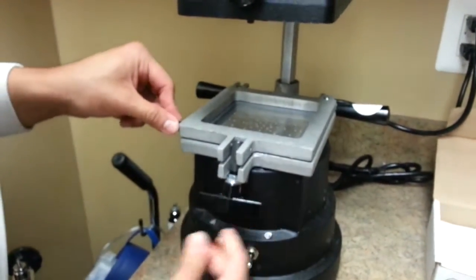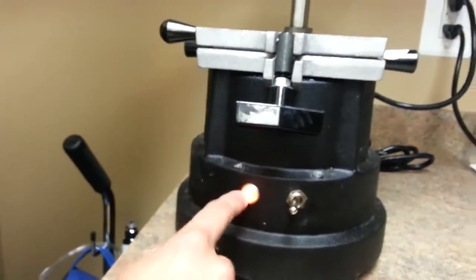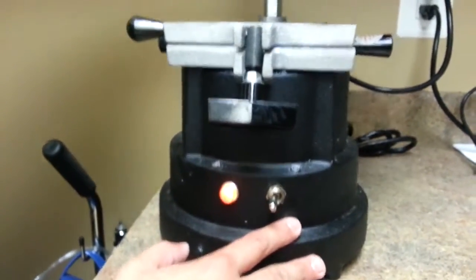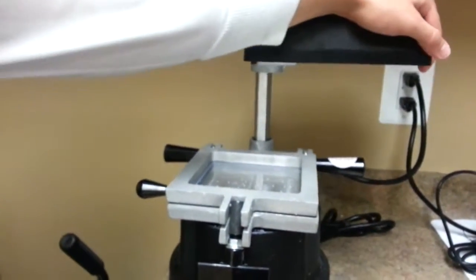We're going to close this up. Now, I'm going to take this out of here. Now, there's a switch right here. One is for once you see the light turn on, that means the heater is on. So, we need to make sure that we let the heater just heat up. So, we're going to put it to the side.